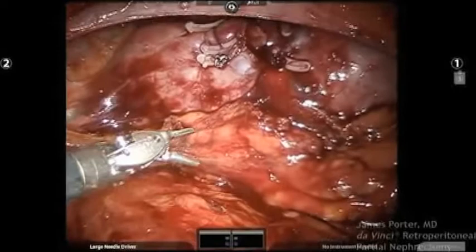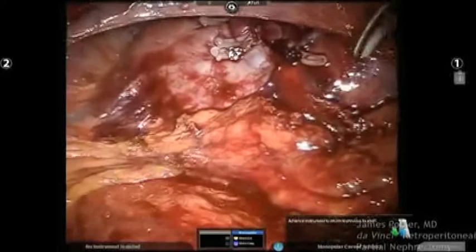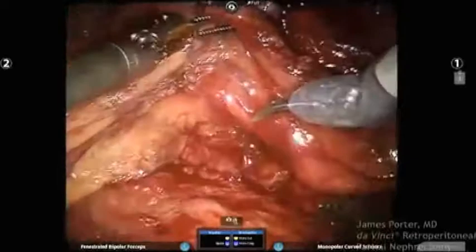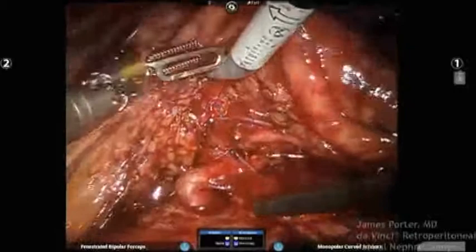I think the majority of the reason is either a bifurcation of the renal artery or an accessory renal artery, and if the vein is clamped, you're just developing an increased pressure and buildup. But it's something to think about in the back of your mind: to really skeletonize that hilum and expose all the vessels, and to look on your preoperative imaging to see if there's a branch.